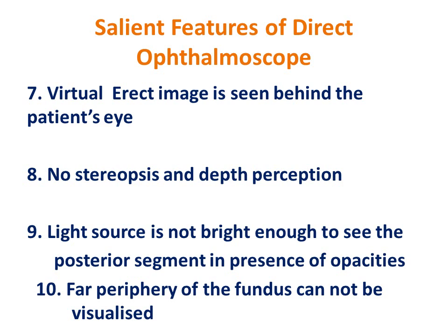But unfortunately, the negative points are that no stereopsis or depth perception will be present when you are using the direct ophthalmoscope. The next disadvantage is that the light source is not bright enough to see the posterior segment in the presence of opacities like cataract and vitreous hemorrhage.